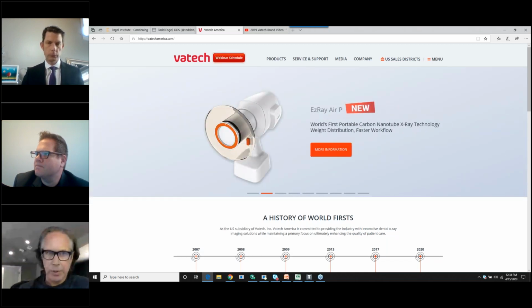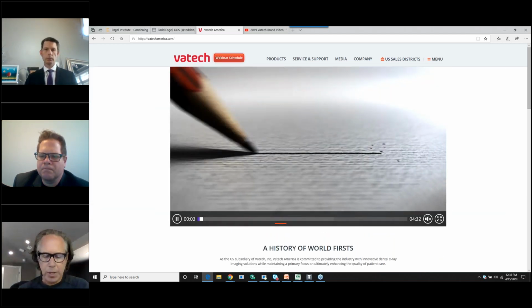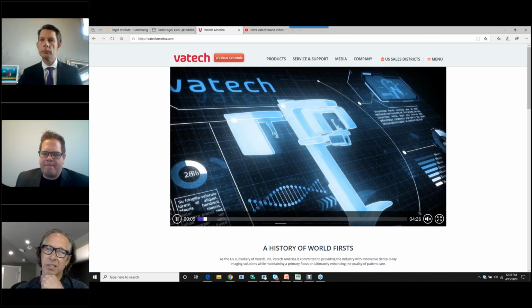These webinars, especially one that's built like this one, typically bring a lot of 2D users, or a lot of individuals that are new to 3D. And I just want to make one suggestion from a clinician standpoint, which as dentists we're not very good at typically, but I try to employ it myself as I learn. Don't be too intimidated with the technology.